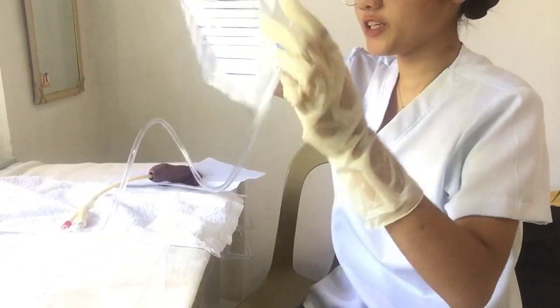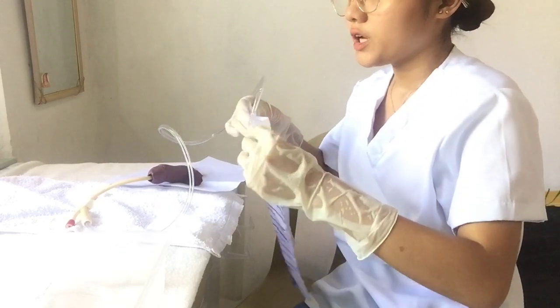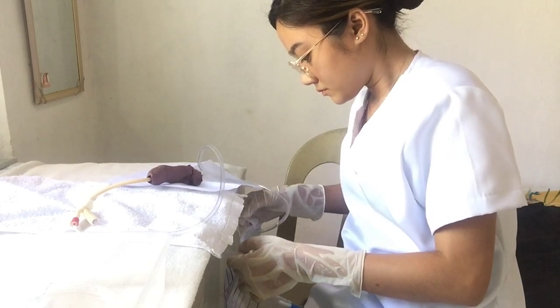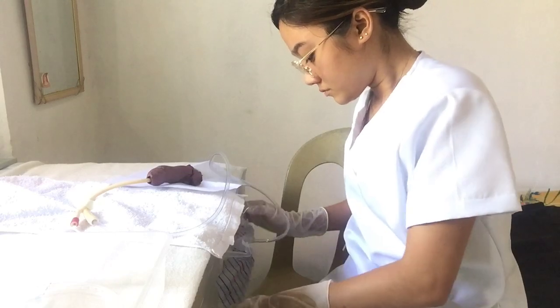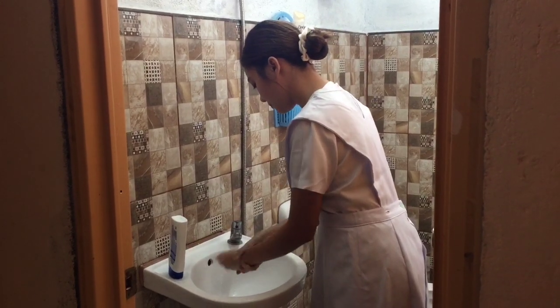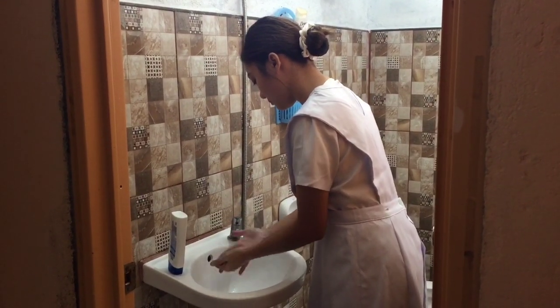In an uncircumcised male, gently replace the foreskin over the glans. Attach the drainage bag to the bed frame, coiling the tubing to ensure it does not fall into dependent loops. Then discard the gloves and perform hand hygiene. Record the time of procedure completion, the size of the catheter, the amount and color of the patient's urine, and any adverse patient responses.